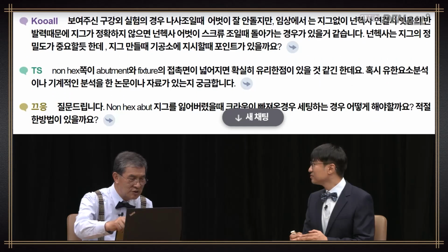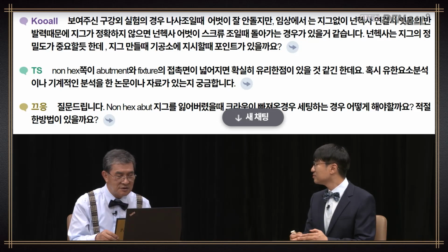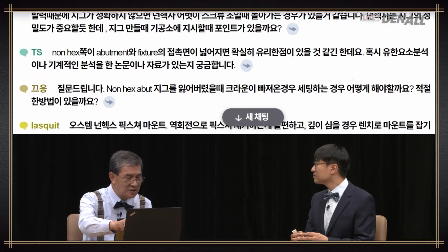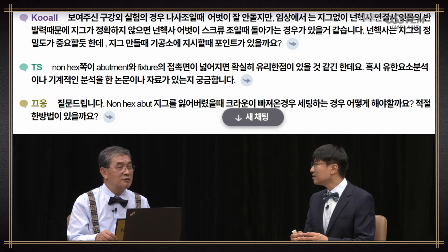In the extraoral test, when a screw was tightened, the abutment did not rotate, but clinically speaking, without a jig, if you connect the non-hex, due to the resistance from the gingiva, if the jig is not accurate, the non-hex abutment can rotate upon screw tightening. Precision seems to be essential in the non-hex jig. What kind of instructions can I give to the lab? How should the jig be fabricated?